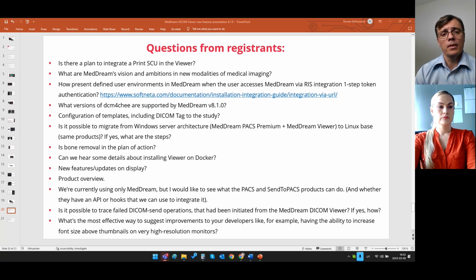Okay. Another one, can we hear some details about installing the viewer on Docker? This is already well described on our YouTube channel. Marius gave tremendous training on how to deploy and configure MedDream on Docker, and I really recommend you search our YouTube channel. You will find the precise half-hour training, and after this training, you will be an expert on how to deploy it. Okay, thank you.